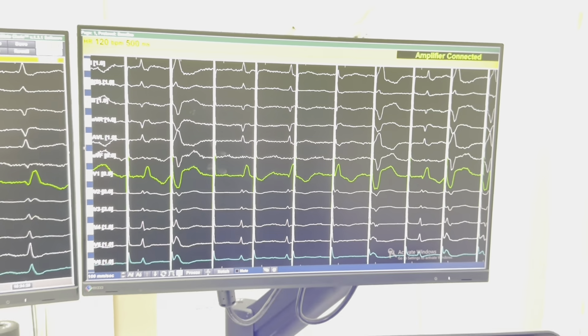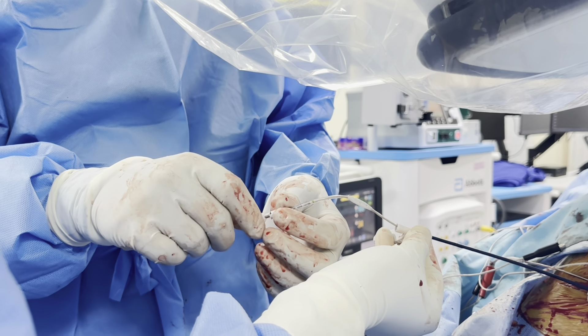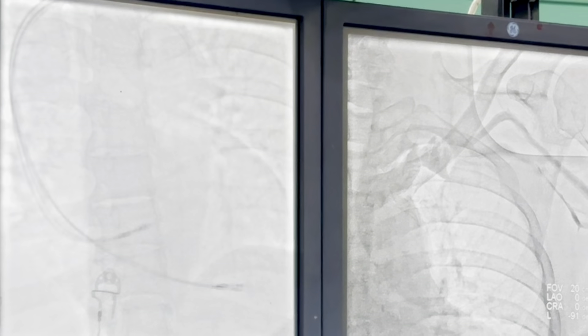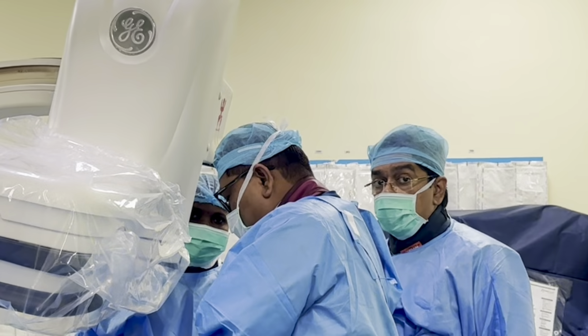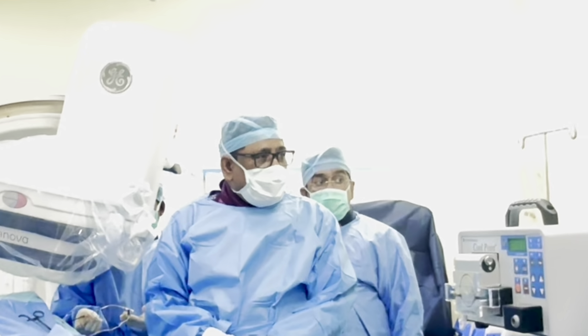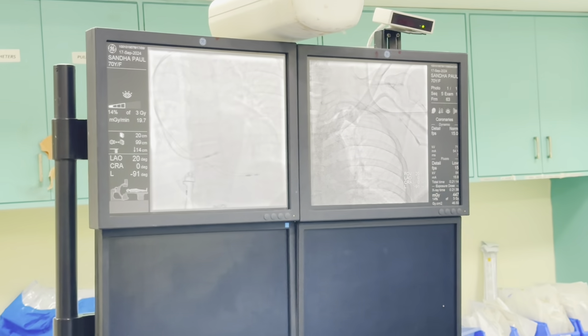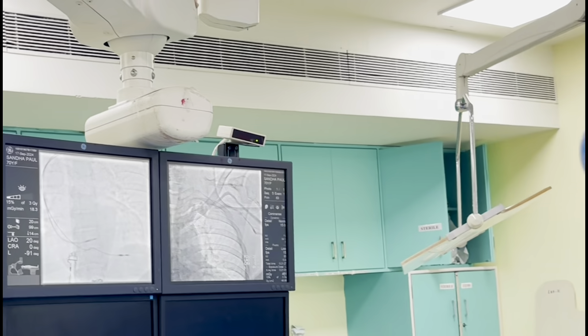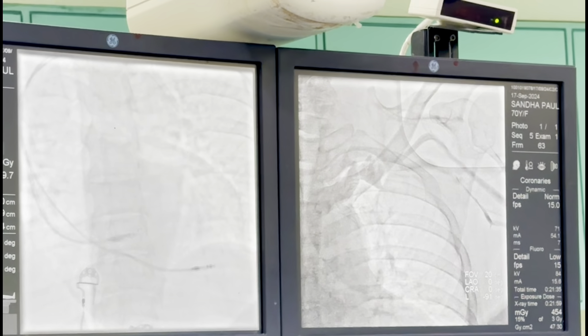Now we will try to get it in. You can see this helix locking device and the kind of turns you do. Simultaneously you see in the fluoroscopy that it is advancing. It is advancing a bit. Now we will check after advancement what has happened to our lead. Any tips on successful drilling of the lead? Yes — it has to be very slow, it should not be fast. Now we will pace from here and see the W pattern, then we will make changes.